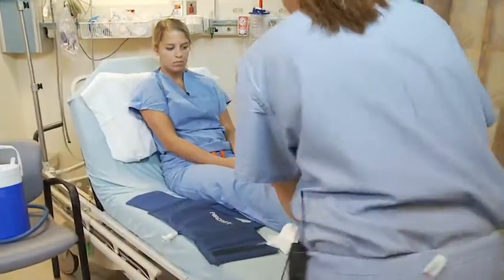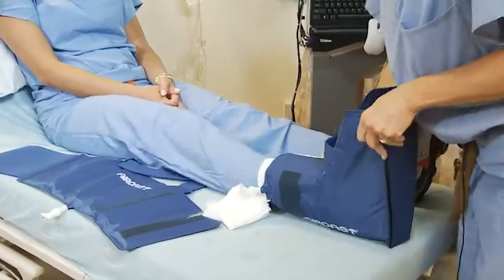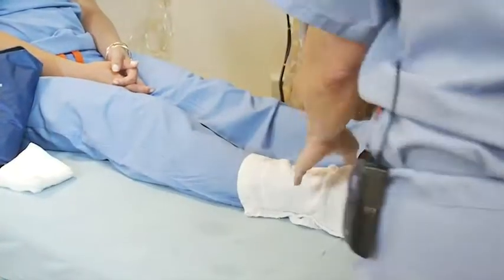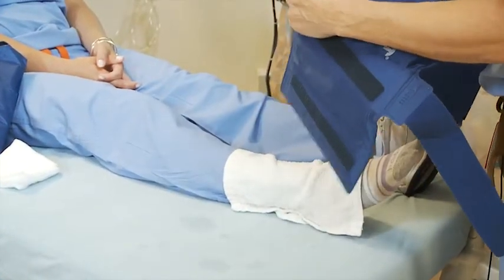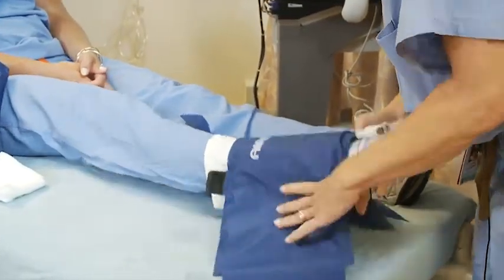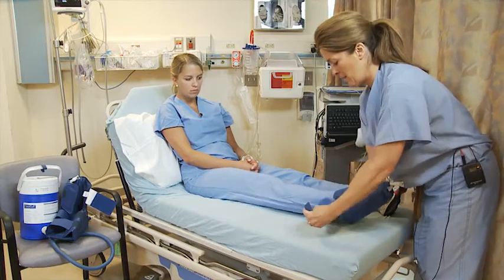I'm going to show you how to connect the foot part of the ice cuff, in case you were sent home with that. Again, you're going to make sure that all skin that is exposed is either covered with a towel or a pair of socks. Lift the foot right up and wrap around the foot. Then this strap goes around the ankle and connects.